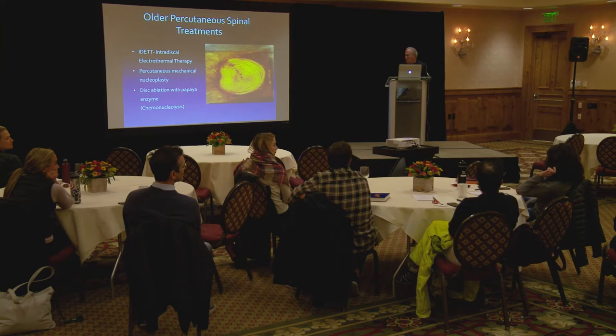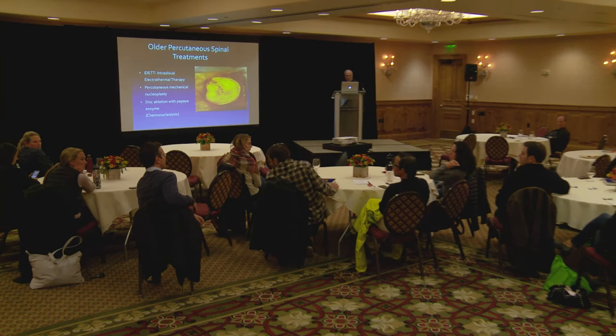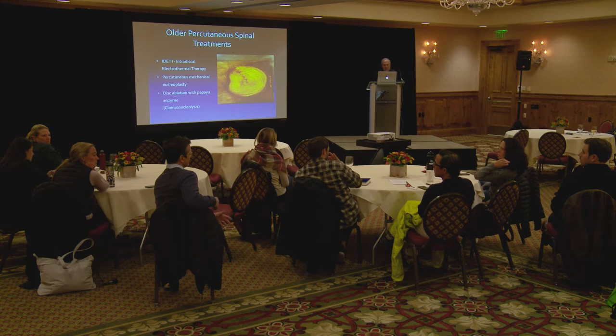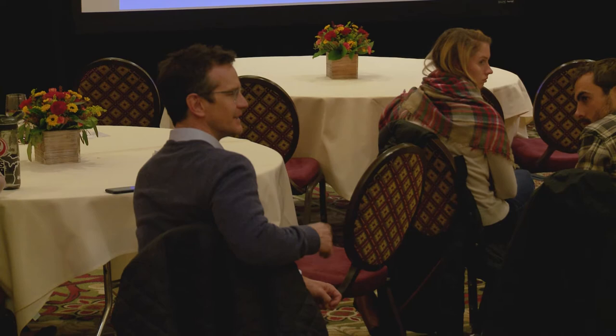Hey, how do you feel about medial branch blocks versus facet blocks? I think the literature, what's coming out now in the Spine Intervention Society, is they prefer medial branch blocks, but I was trained by a guy who did primarily intraarticular facet injections, whether it's cervical, thoracic, or lumbar, and I feel like the feedback we get from that is always better in certain cases. It's difficult to enter the thoracic spine. I feel the same way.